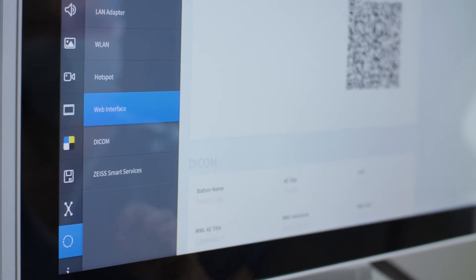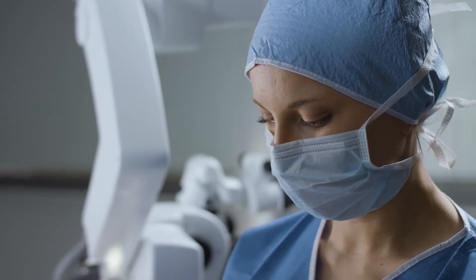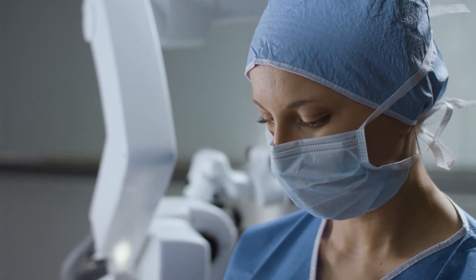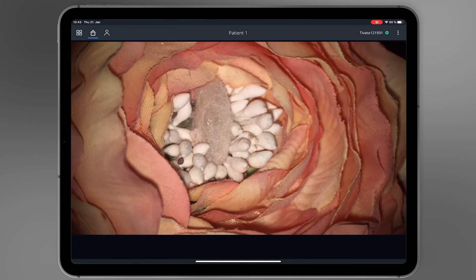Finish the Setup Assistant to establish the connection. The starting screen shows the live stream of the connected system.